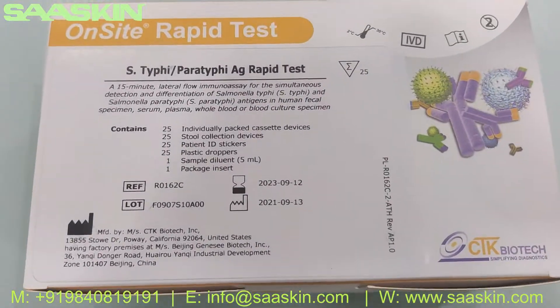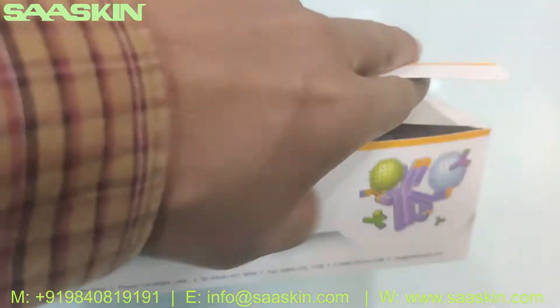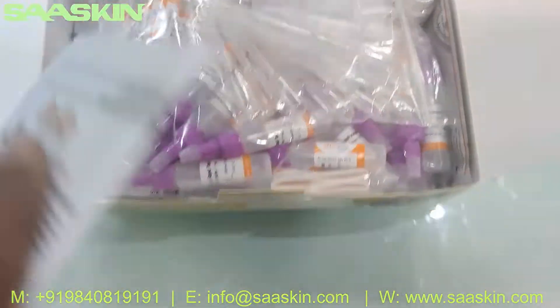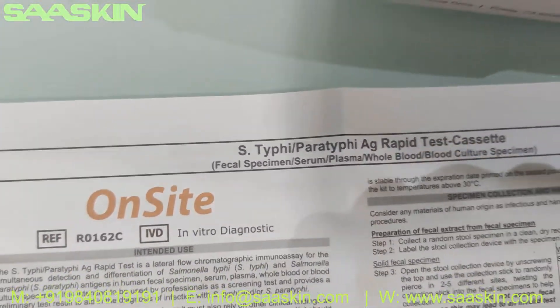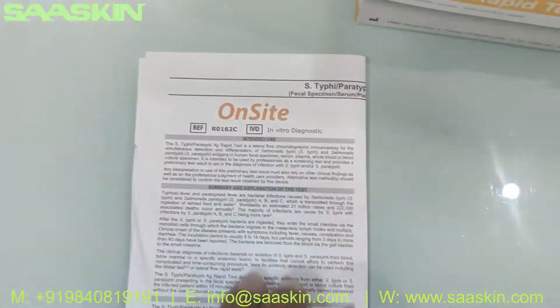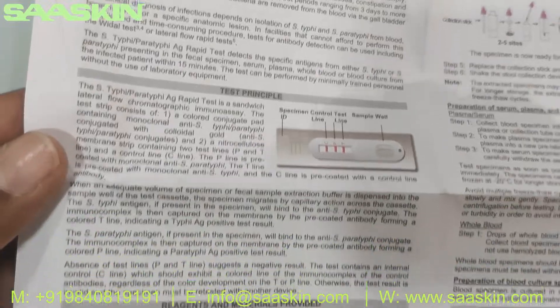So this is the kit. Let me open this box — okay, got it open for you. You can see the inside contents of the box. Inside you got the complete IFU brochure for this antigen test kit — it's for S-typhi/Paratyphi antigen rapid test cassette. You got the complete instruction manual for sample preparation, completing the test, and interpreting the results. This is the complete guidance for completing your test procedure.